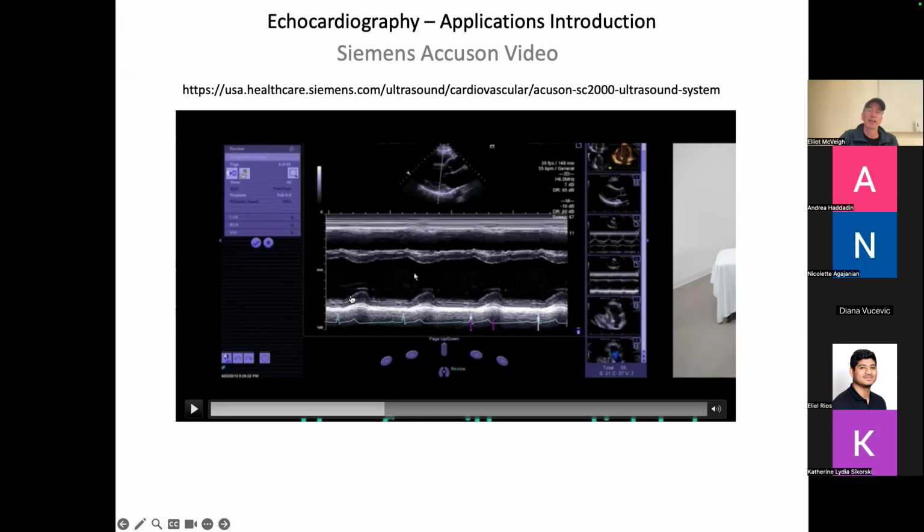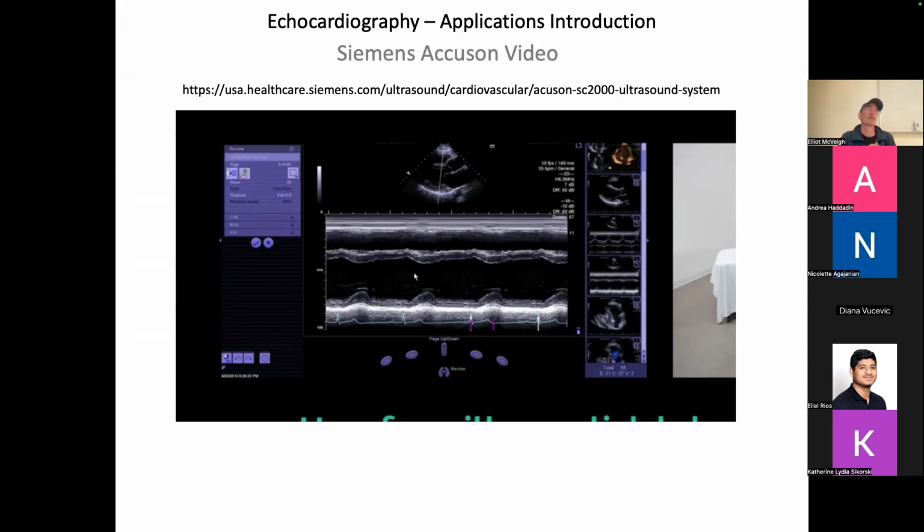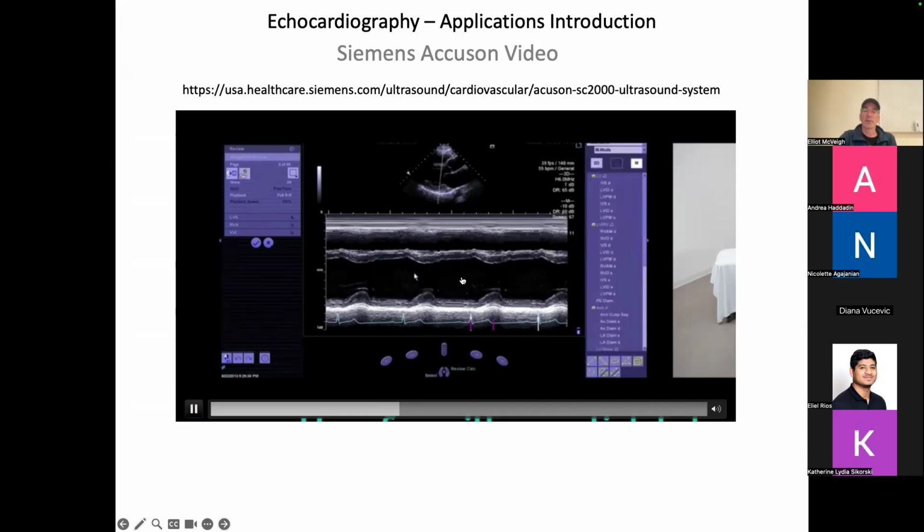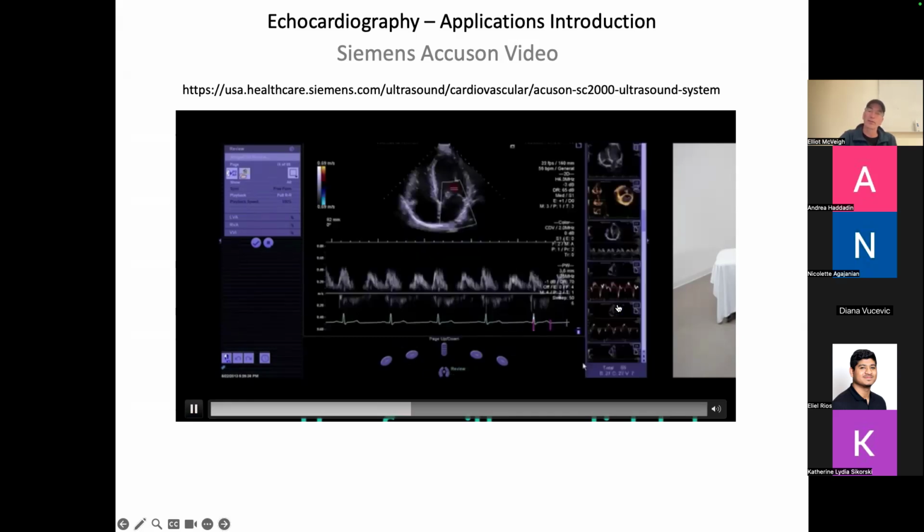So this wall goes down like this wall goes like that. I look up here, it's this wall and this wall. So they're coming together, right? And you can measure precisely how fast they're coming together to get an idea of the rate of strain of that. And then you can repeat that over time. So that's called M mode. And you can do a lot of quantitative estimates of what's going on with M mode.